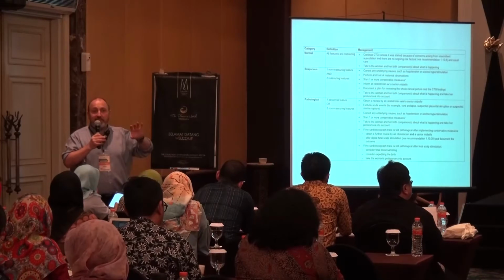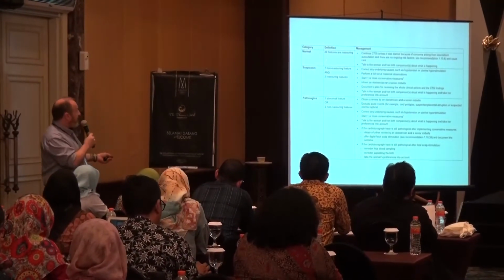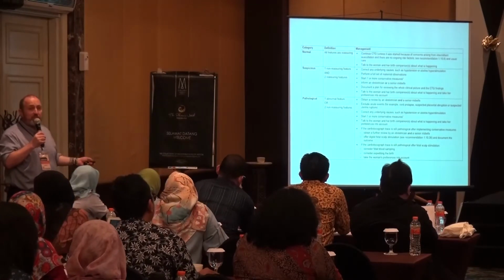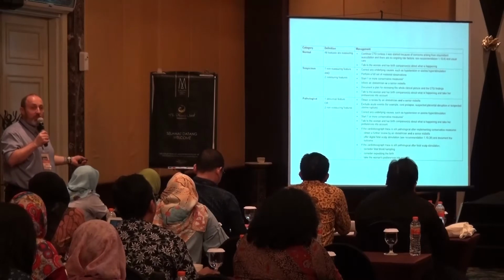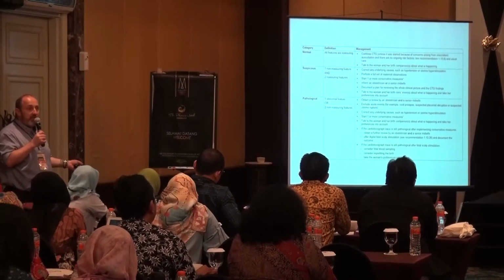Now, when you come to classify the overall tracing, you put all that together. They say, very easy, if all of those features are reassuring, the tracing is classified as normal. If one of those features is non-reassuring, it suggests actions that you consider depending on your classification of the tracing.